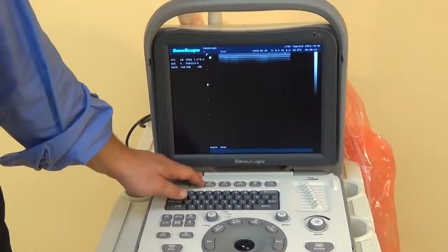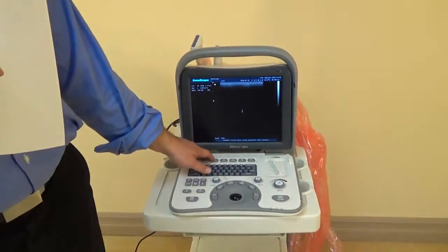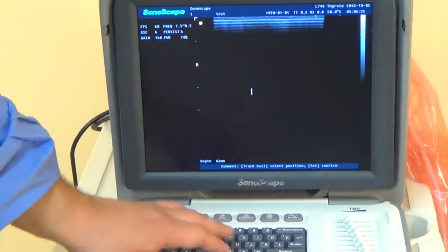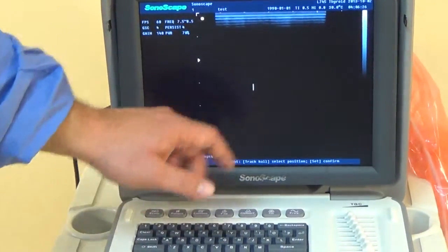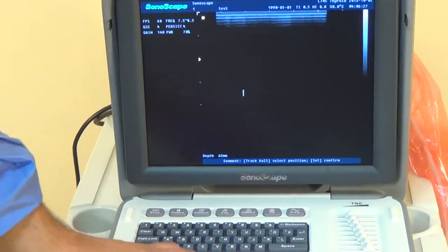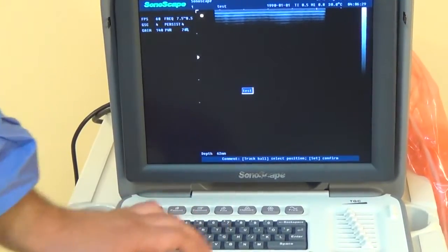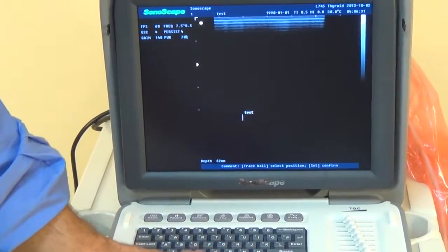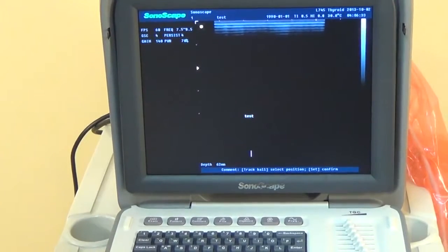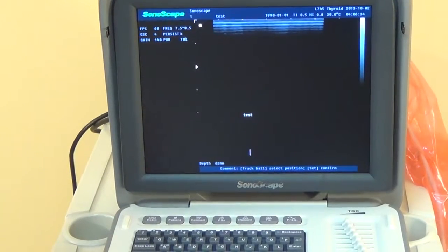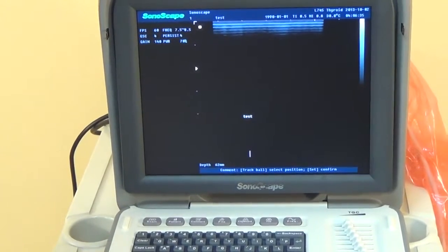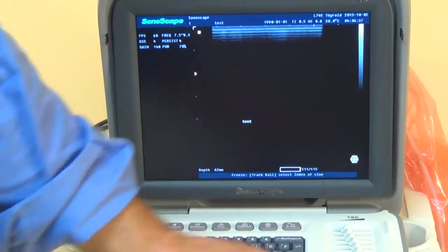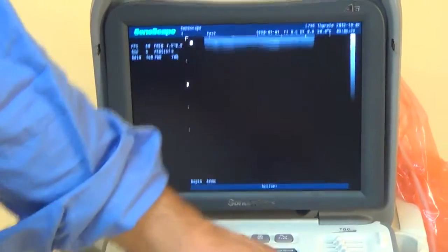Next very popular button is the comment button. When you press it, you get a cursor. You then go ahead, set that cursor where you like, set it, and that's where it will stay until you unfreeze it to the next image. So that's a button that pretty much everybody uses pretty often.